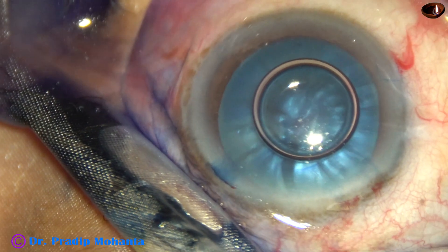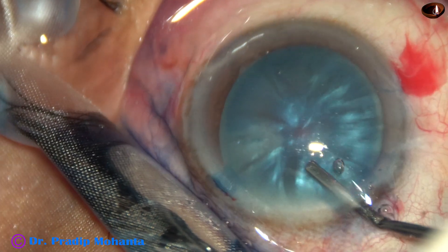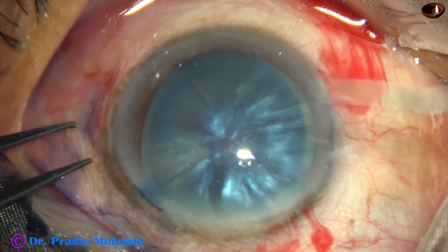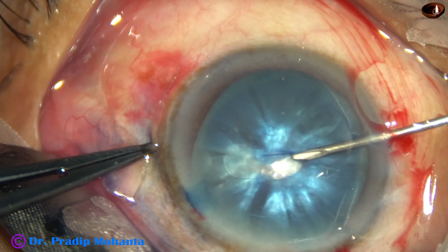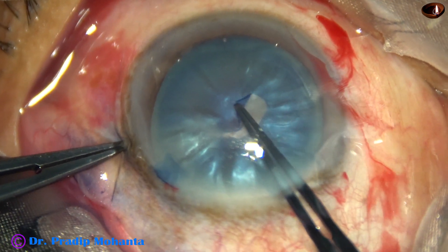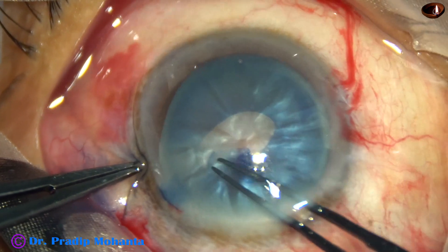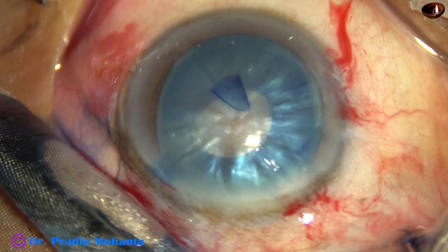I wash the dye out and then I inject 2% hydroxypropylmethylcellulose. Now I have to include that area where I have already pierced the anterior capsule inside the minirhexis. So here it is — I could find out that area where I have pierced. From there, I just extended the tear. And now, with the help of the utrata forceps, I am doing this minirhexis. And that point of piercing is inside this area.